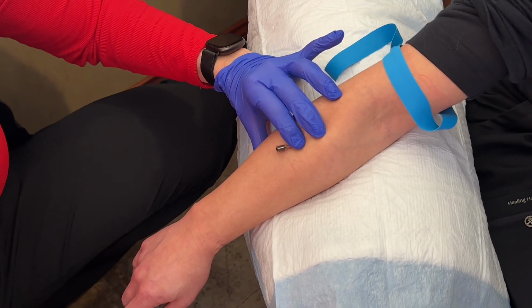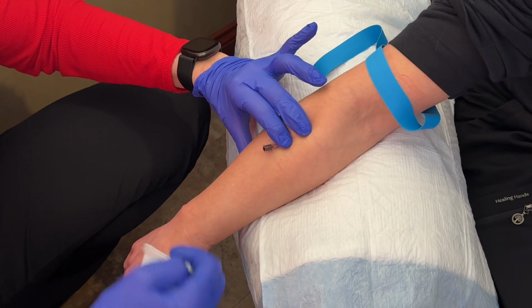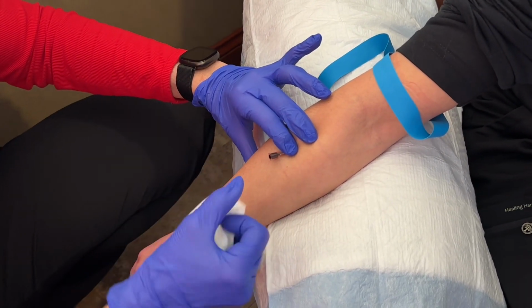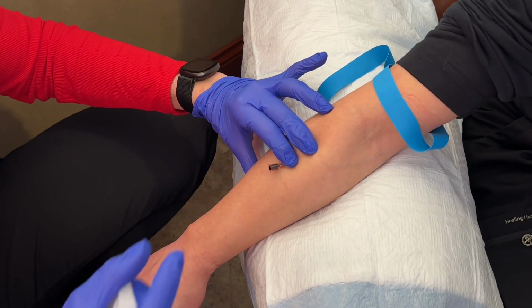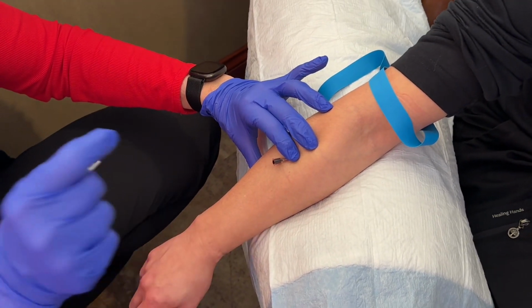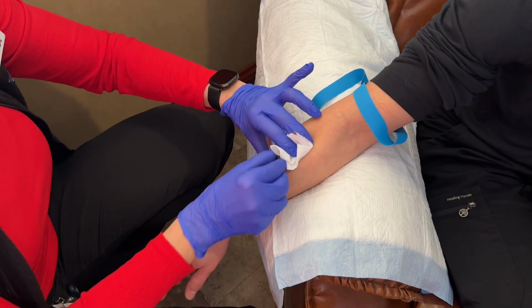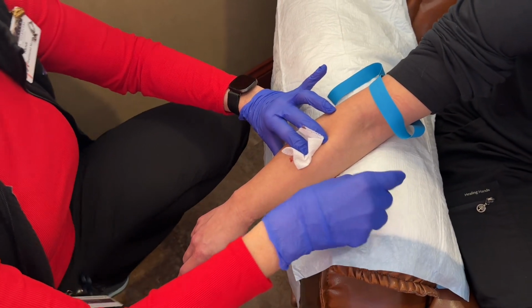Even in nursing school, my nursing career, I have always used lidocaine. It takes the bite out of the IV. If you inject a good wheel, very superficial like you're supposed to, like a TB wheel, some people don't even feel it at all, and they should not feel the insertion of that IV, which is most people's complaint of what hurts. So we're going to go ahead and pull this out. And that is how you do lidocaine.